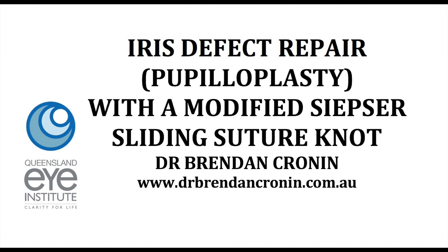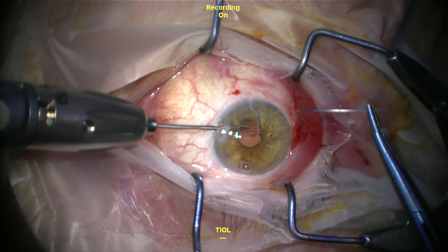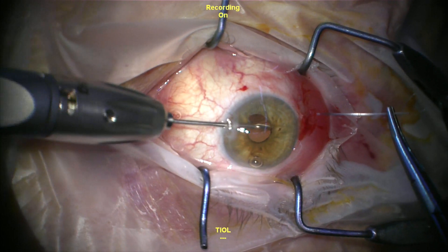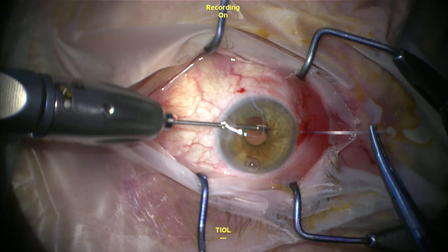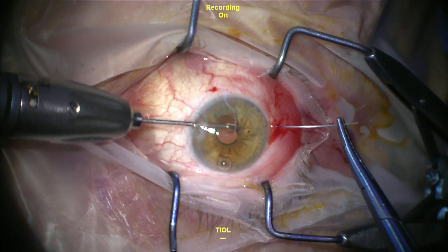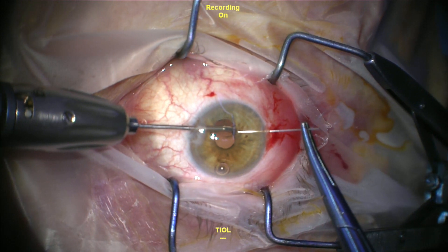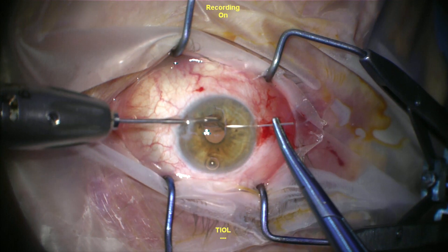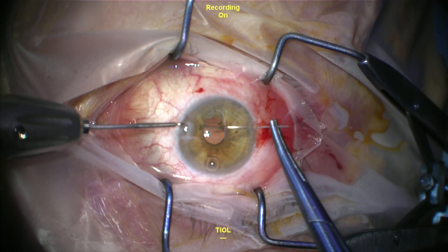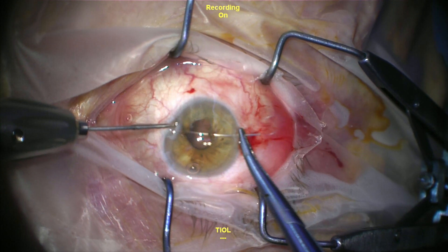This is Dr. Brendan Cronin from the Queensland Eye Institute demonstrating a modified Siepser knot for pupil repair in a case of a patient who had traumatic pupil damage during cataract surgery at another institute. I'm using a 10-0 Prolene suture and micrograspers in this case. The handshake technique could also be used with a 25-gauge needle for removing the sharp end of the needle with the distal wound.